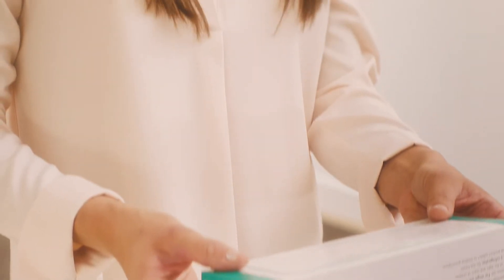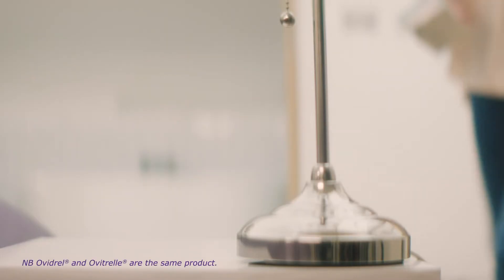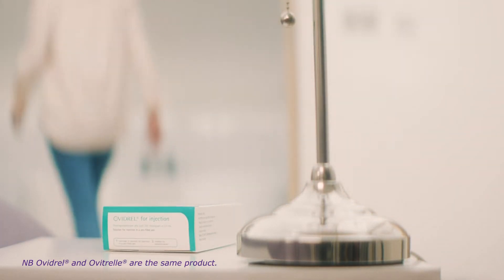Check the expiry date on the pen in the box before using your Ovidrel. If the pen has expired, then please do not use it and contact your doctor. As well as watching this video, make sure you read the leaflet that comes in your pack with your pen and speak to your doctor or nurse if you have any questions.